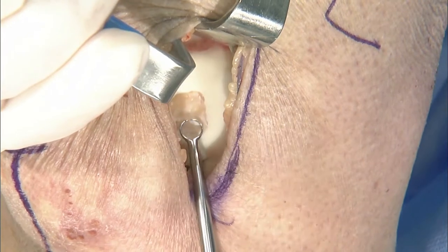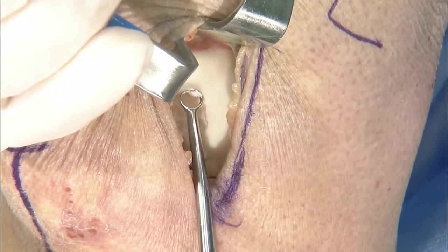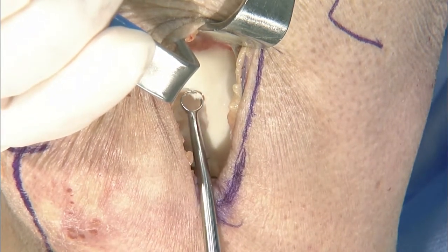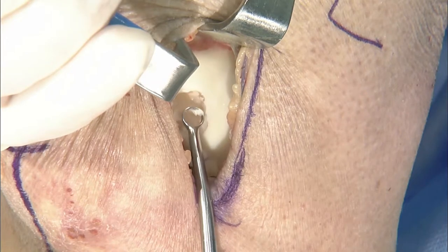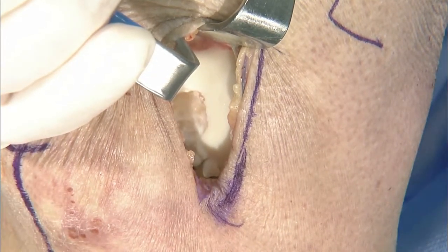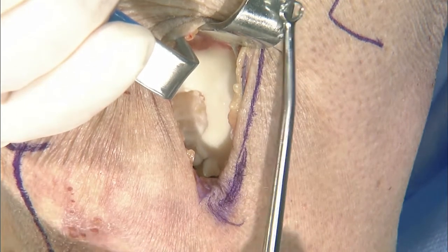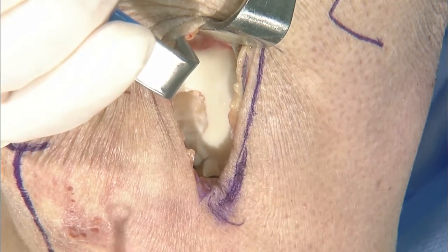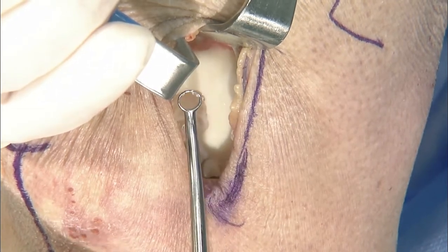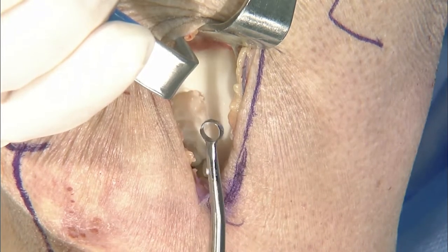I think starting in the middle right here, you have a tendency to end up in the middle when you're prepping from in, and you'll get a little bit more of a hole in this area. So focusing on that rim first is incredibly important. And there's all sorts of different things that you can do for that. You know, these ring curettes are great, but sometimes depending on the angle, standard curettes actually can work a little bit better. I think the knife is really important, but most of the time, 80 to 85% of the time during defect prep, I'm using these.